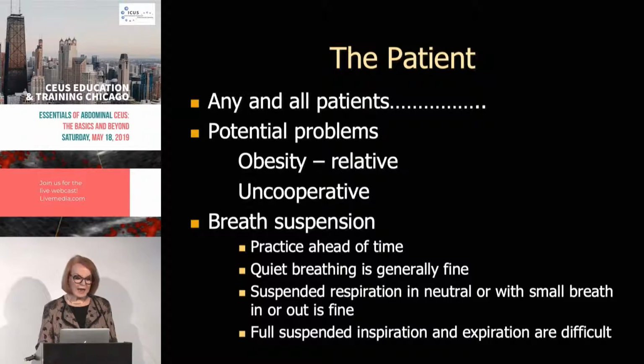Well, so we take any and all patients. And so although obesity is a relative problem, it's not absolute. And I'm going to show you a really good example. Uncooperative patients are, in fact, probably worse than obese patients. And breath suspension, Richard mentioned this, you want to really practice ahead of time.